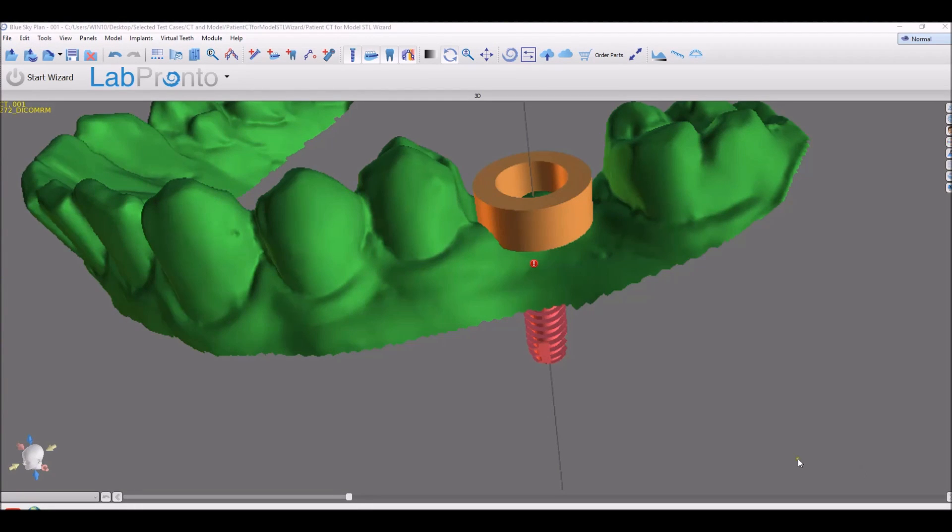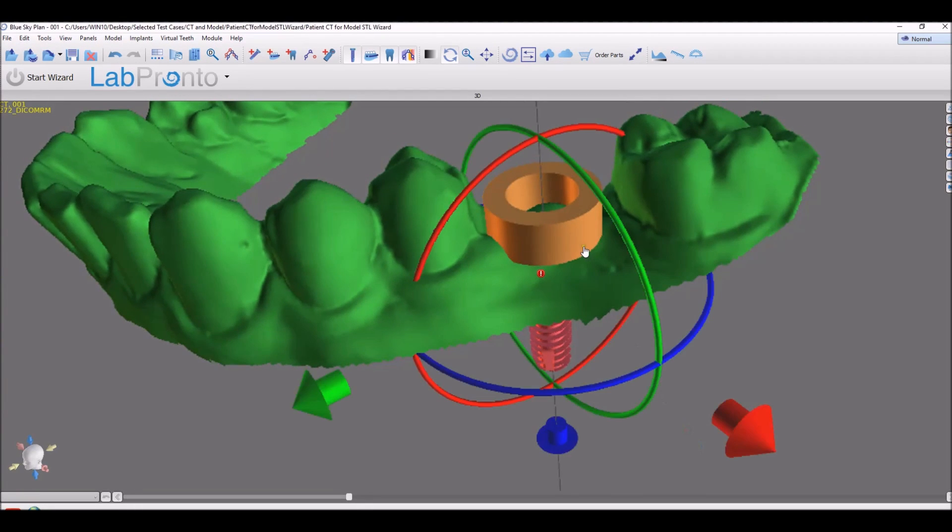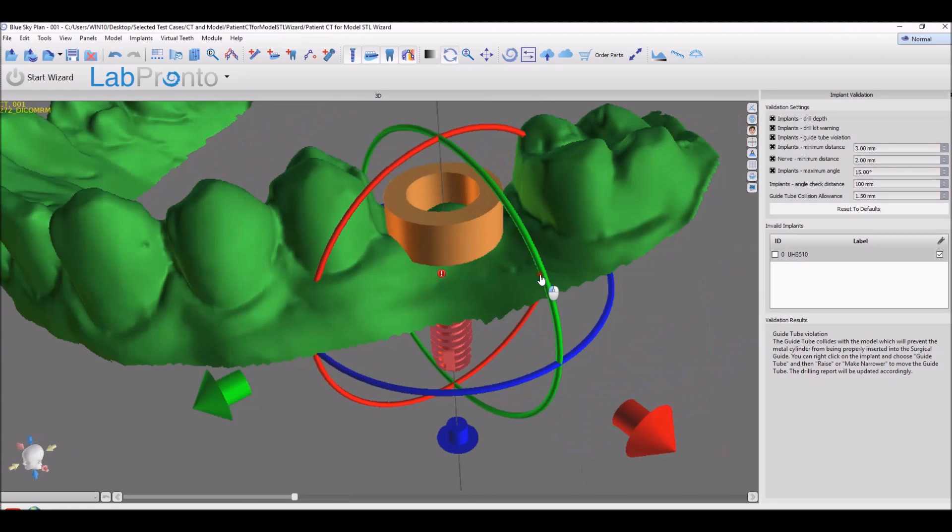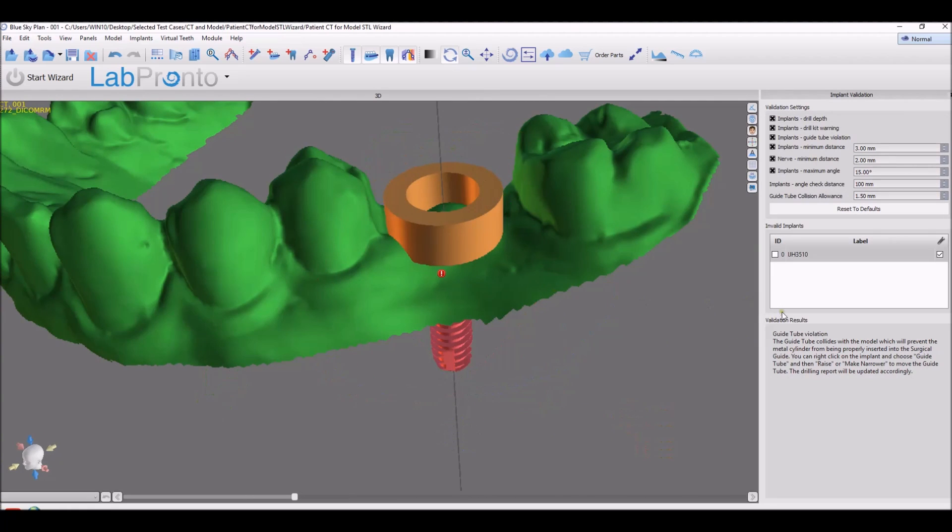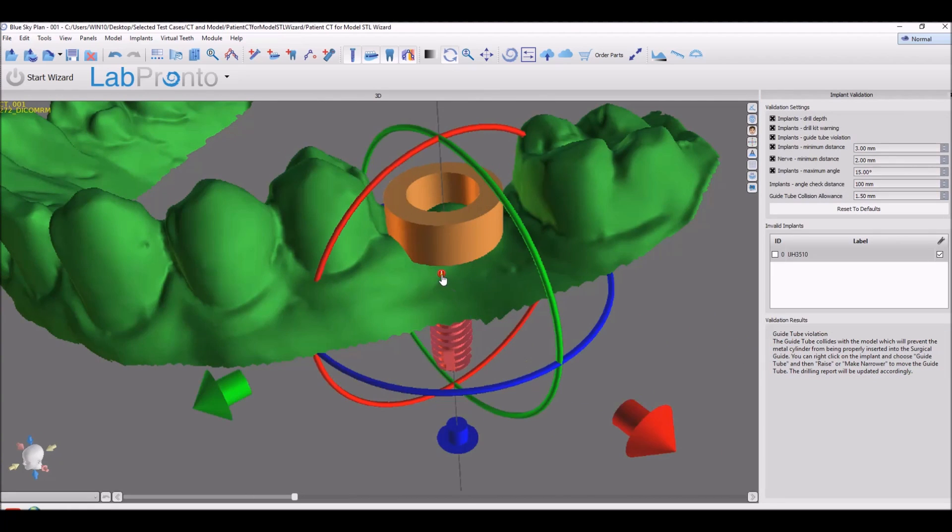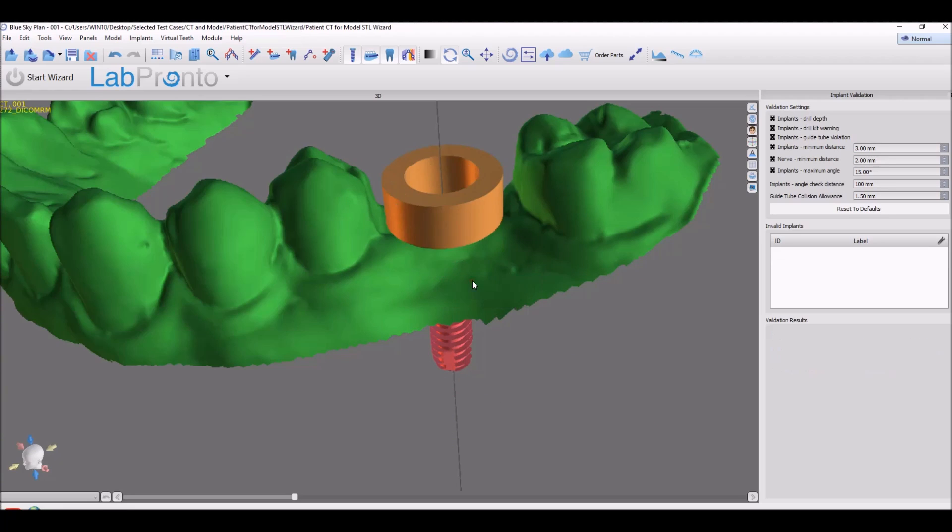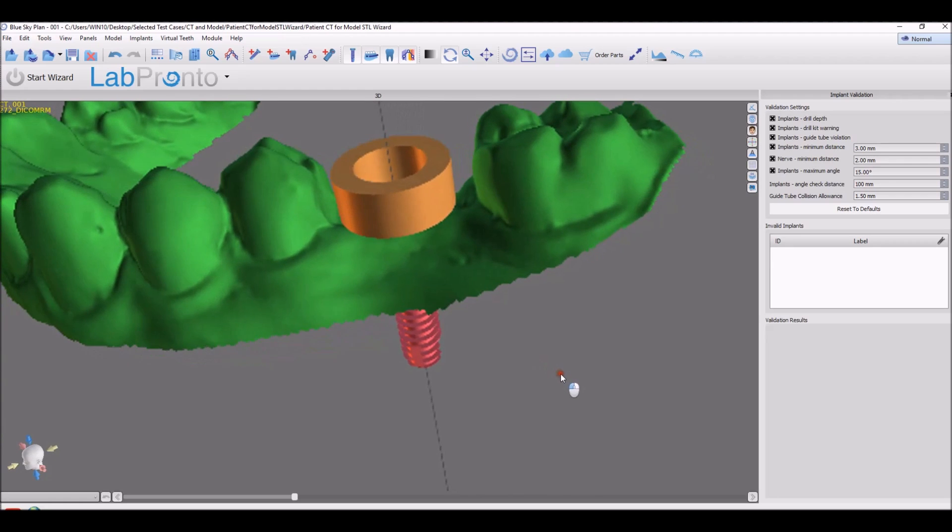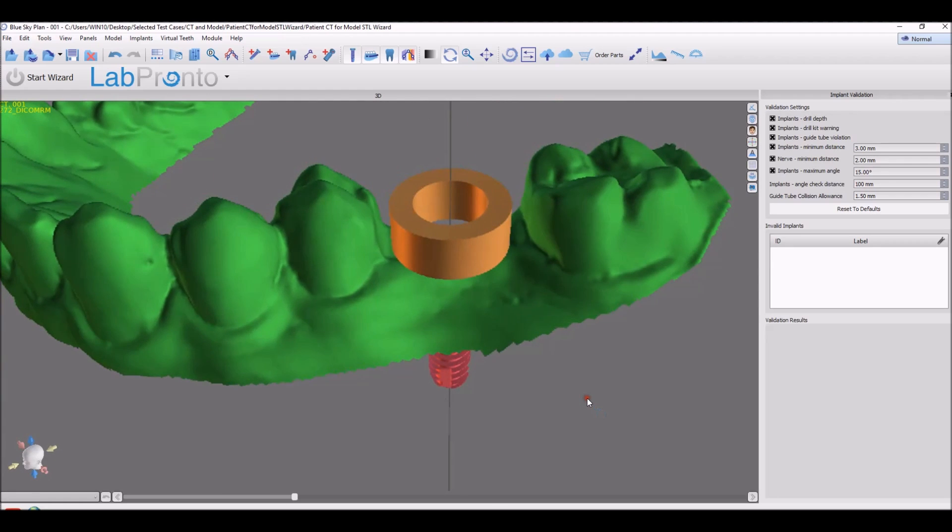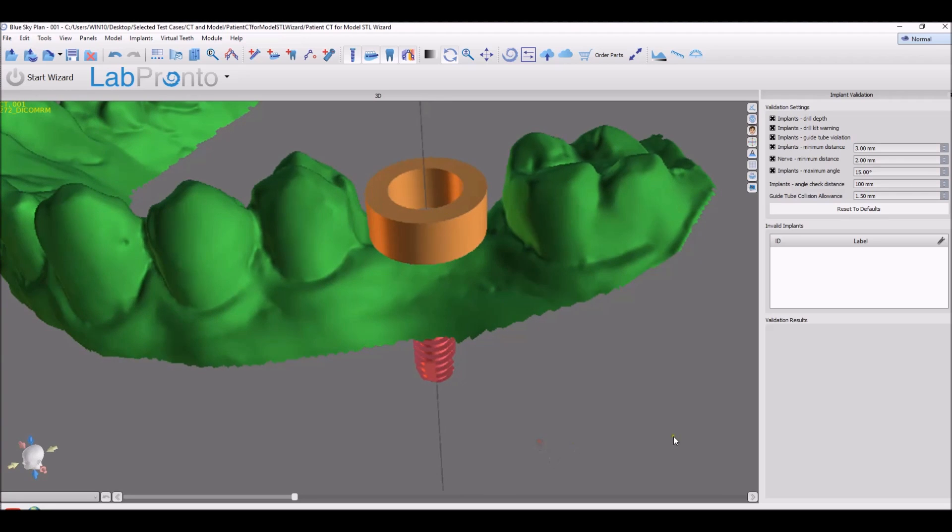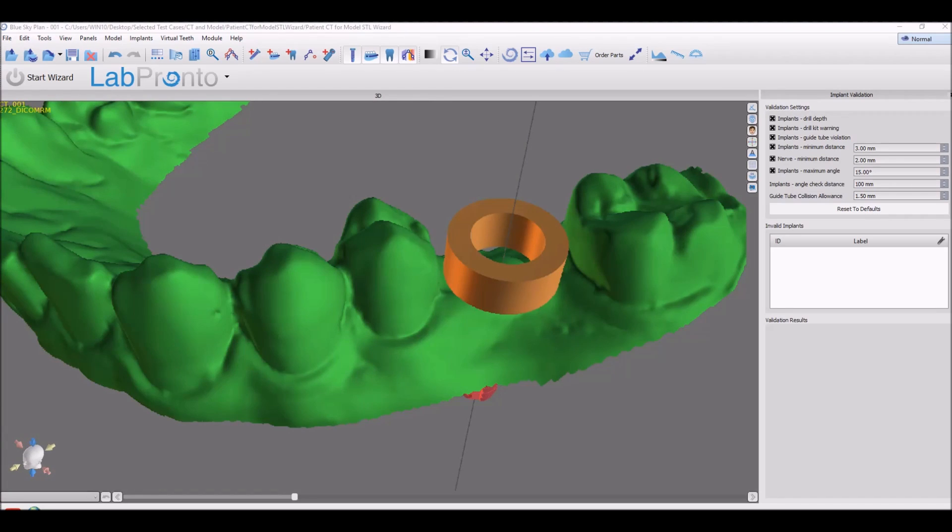We have added a solution for the cases where the surgical guide tube interferes with the model, with the patient's anatomy, or it's too wide for the adjacent teeth. You could double click on the exclamation mark and see the guide tube violation. But to solve it, you could just choose raise guide tube or make guide tube narrow to solve the relevant problem. The software updates the information on the drilling reports for the particular guided surgical kit and implant system being used. There's no longer a need to recalculate the offset and update the drilling report manually.